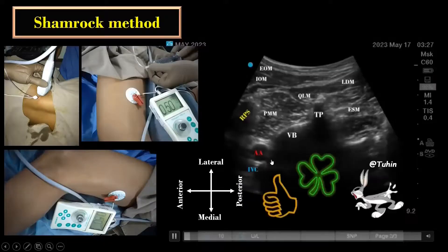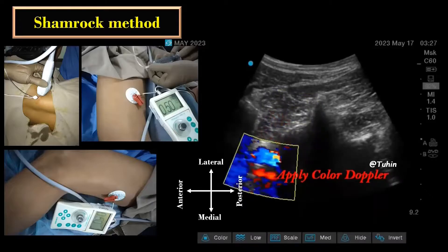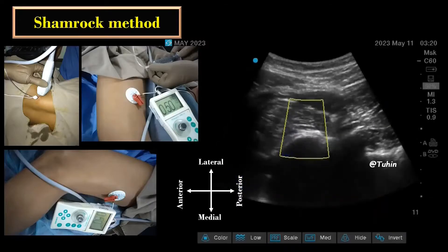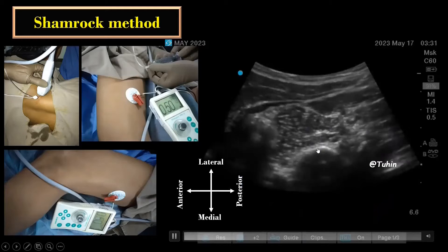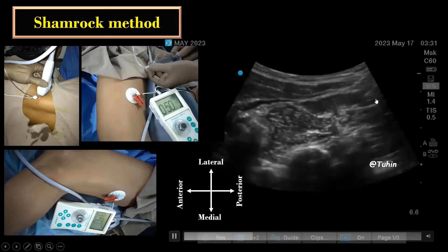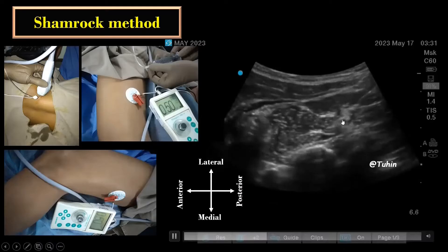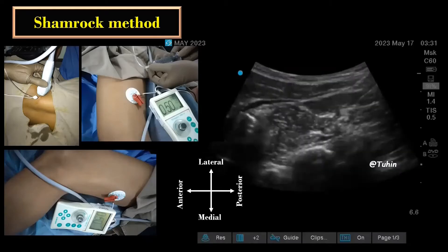The shamrock method gives an excellent view of the lumbar plexus and the surrounding anatomy. Once you identify the sonoanatomy, switch on the color Doppler or power Doppler to identify the major vessels, as well as the presence of vessels like the dorsal branch of the lumbar artery or ascending lumbar vein inside the psoas muscle or at the level of the intervertebral foramen and along the proposed needle trajectory. Once the inter-transverse space view is obtained, a nerve block needle is inserted and gradually advanced in a posterior-to-anterior direction under real-time ultrasound guidance until the needle tip reaches close to the lumbar plexus element.